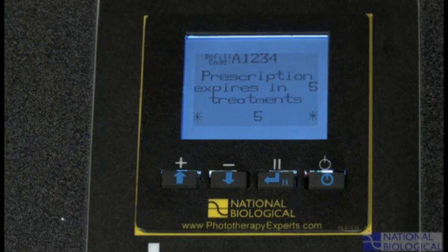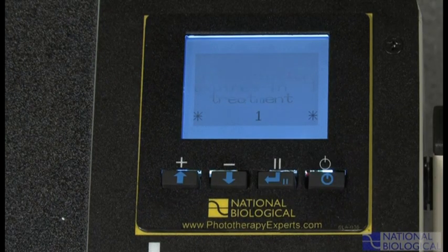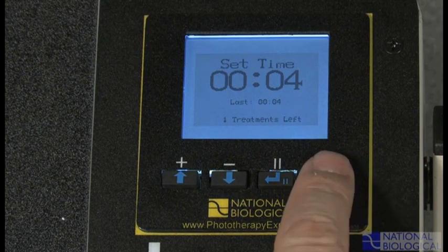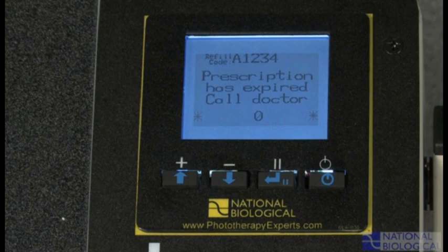When the number of prescribed treatments is 20 or less, it is time to call your doctor to obtain a treatment refill code. If you still have any treatments left, you can press on to proceed to the set time screen. When there are no treatments left, a prescription has expired screen will be displayed. The device will no longer work until you call your doctor and then enter the refill code he or she provides.